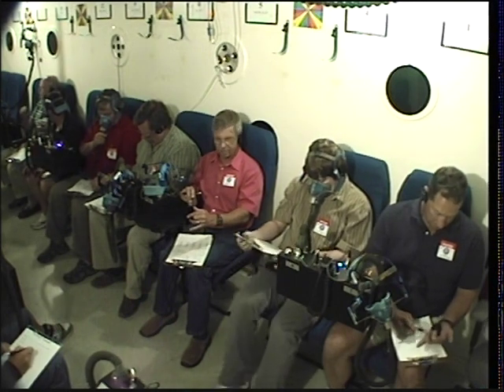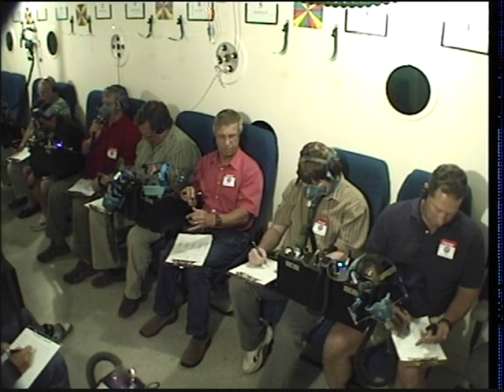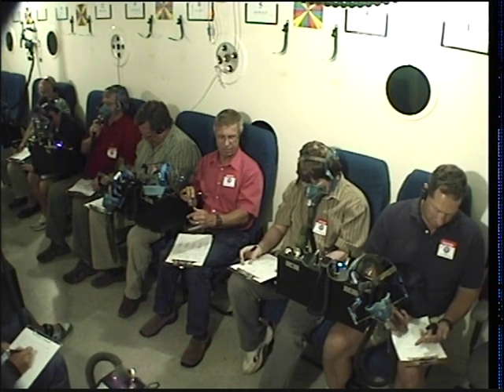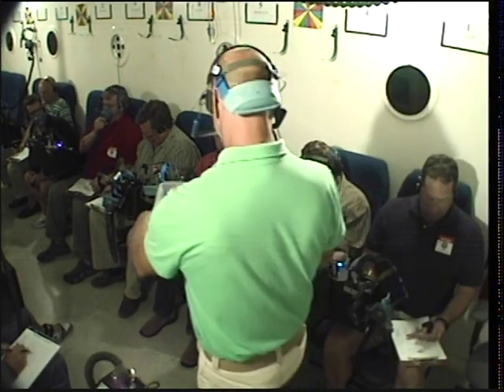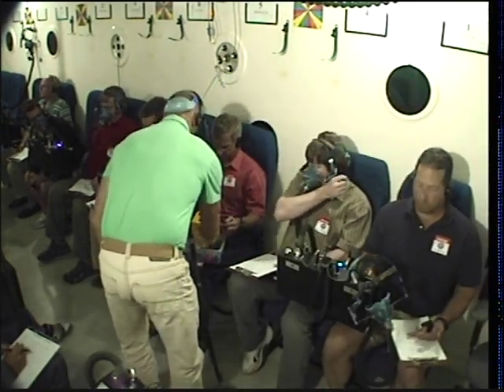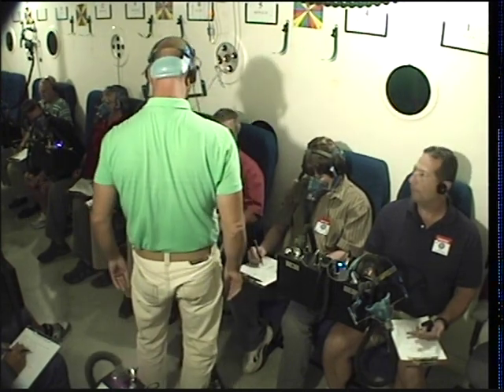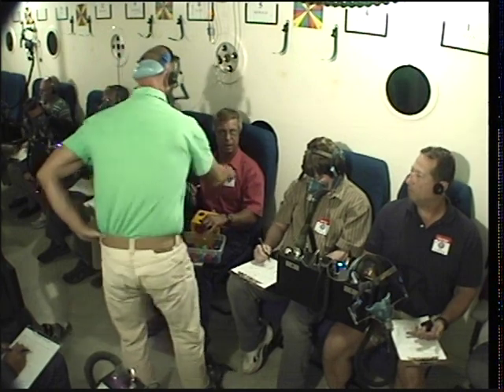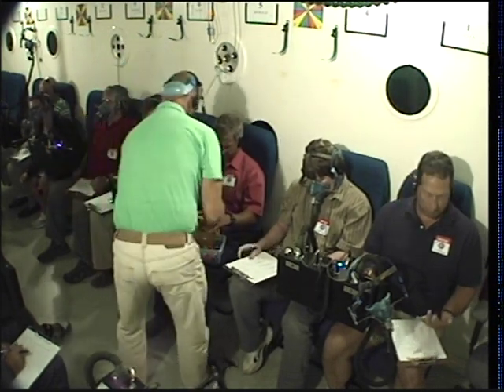Don, you think he's a good candidate for the toy? Is he past that? Don, JR is going to give you a little toy to play with. And what I need for you to do is take a piece of the toy out. Can you take a piece of the toy out, a little shape? And Don, do me a favor. Put that right down your shirt pocket, okay?